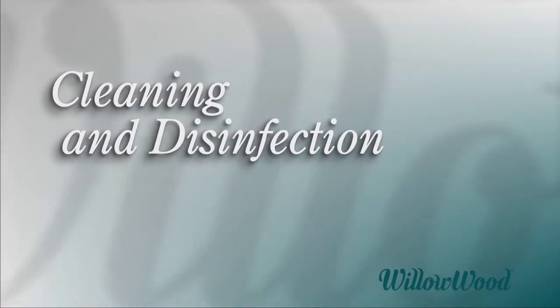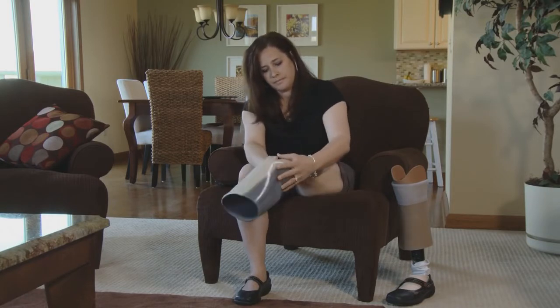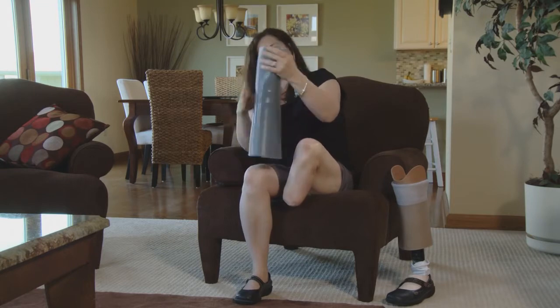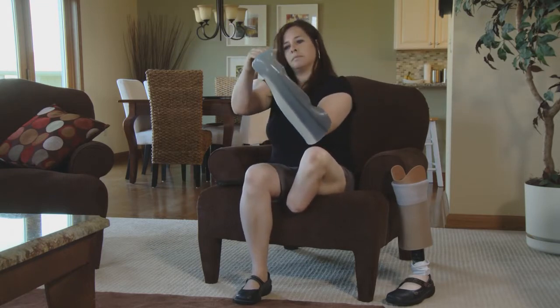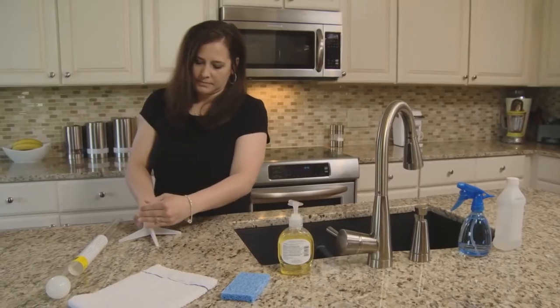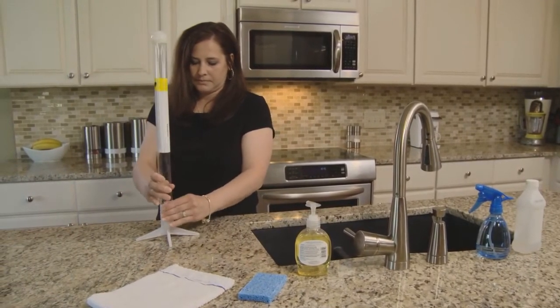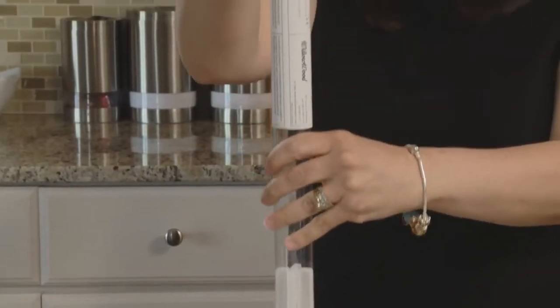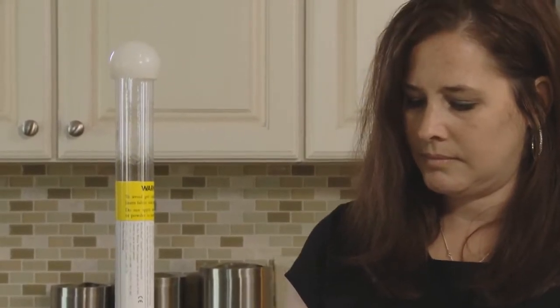Proper hygiene is extremely important when using the Alpha Liner. Each liner must be thoroughly cleaned at the end of each day of wear and disinfected once each week in order to prevent skin irritation. First, be sure to assemble the drying stand that was included with each liner. Start by sliding the two base components together, then place the tube onto the assembled base. You may cut the tube to a shorter length if desired to accommodate shorter liners.